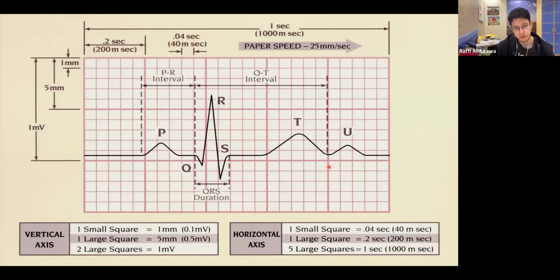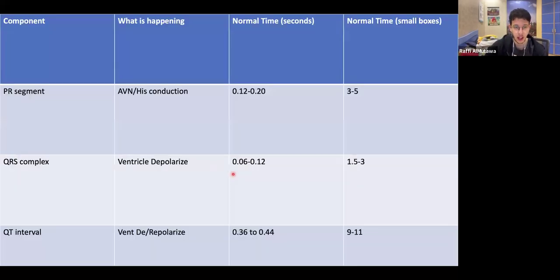If there's anything else that might be important, the P wave only exists because of the sinoatrial node. The sinoatrial node will send out a signal, and this causes the P wave to form in the first place. Specific details other than that, you don't need to know. And because of this, in the PR, the atrial depolarization and repolarization technically happens, but the repolarization is buried in the QRS. Again, nitpicky details, not important for your exam.